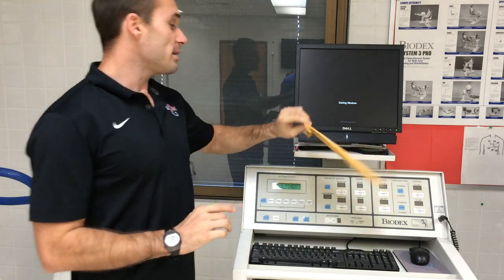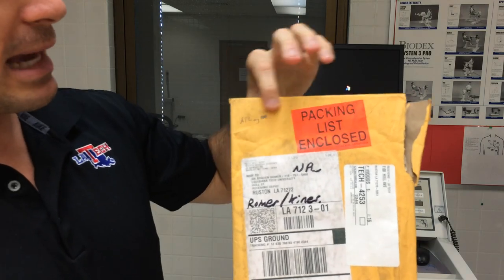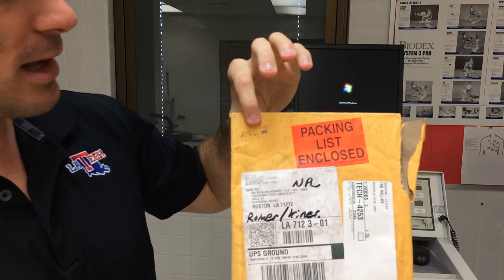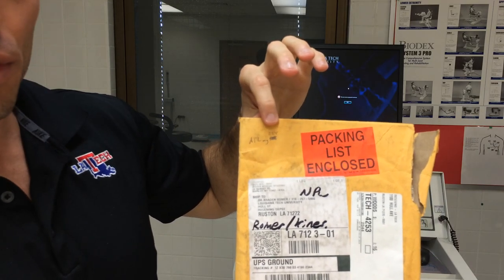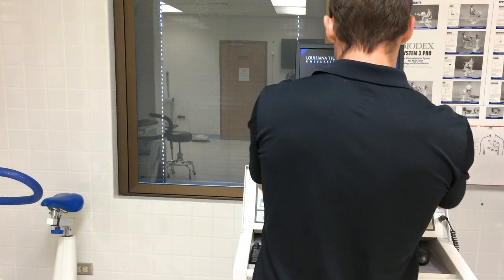The other thing to keep in mind with this equipment is there's a password on the computer. It's right here on this packing list where we keep our manual for the computer. APL in capital letters, MG in lowercase letters, and then 224. Corresponds with Applied Physiology Lab, Memorial Gym, and then room 224. This will always be in here with the computer. We just make sure that's right there.